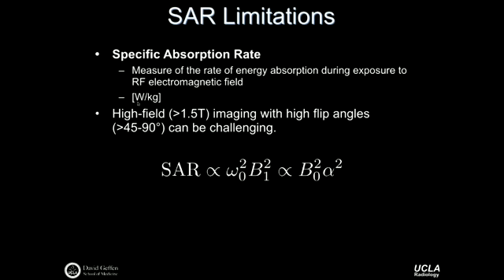We measure it in watts per kilogram, so we're conscientious of how many watts we expose a patient to, for example. And this becomes limiting, meaning that we can't just do whatever we want when it comes to MR. In fact, one of the primary limits in MR right now is the so-called SAR limit. We can't deposit more energy into the subject to do an experiment or an imaging acquisition that we think might be interesting.